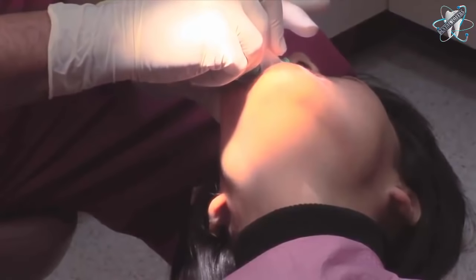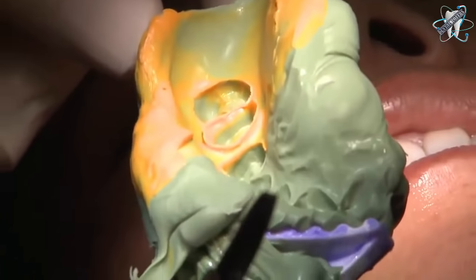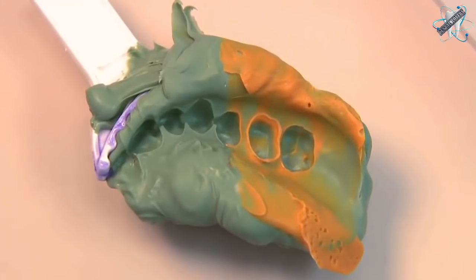Insert the filled closed bite tray into the patient's mouth. AquaSil Ultra rigid material's stiffness when set provides extra stability to resist distortion that commonly occurs in plastic closed bite trays. Mouth removal time will occur at 3 minutes. Remove the impression from the patient's mouth and inspect — a perfect impression capturing subgingival margins.